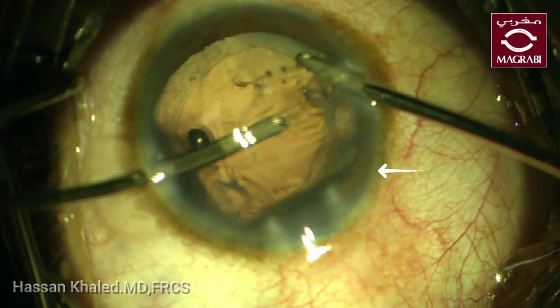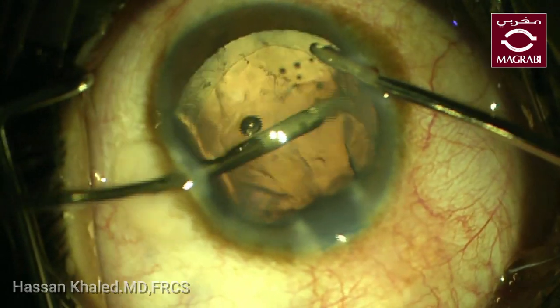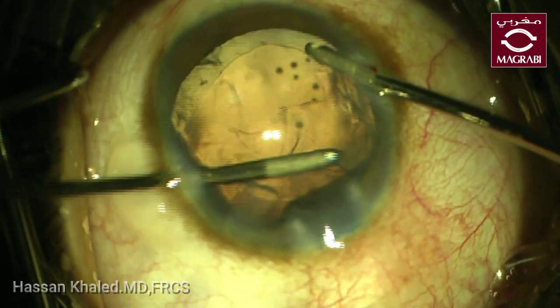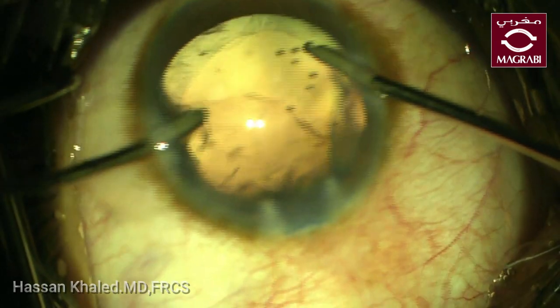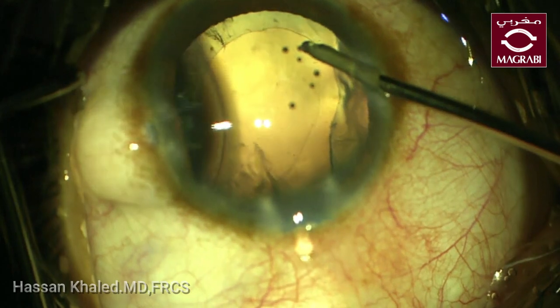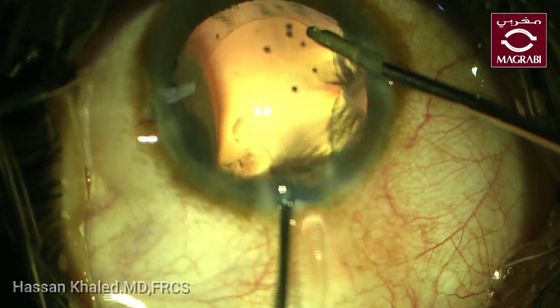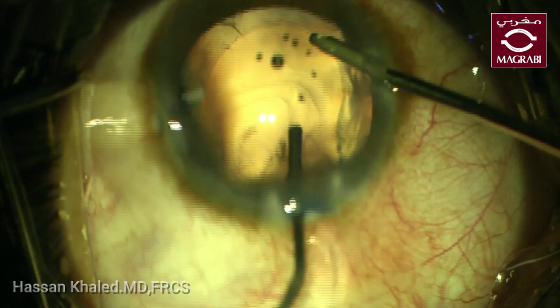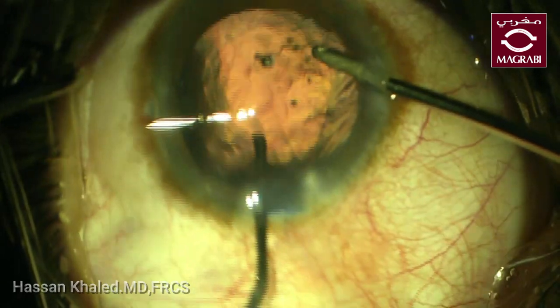As I said before, if this flap is inverted towards the capsular bag and is not fluttering, that is a sign that the extension goes behind the equator — posterior to the equator — and is affecting the posterior capsule.